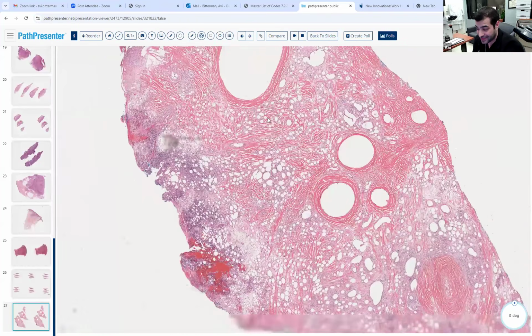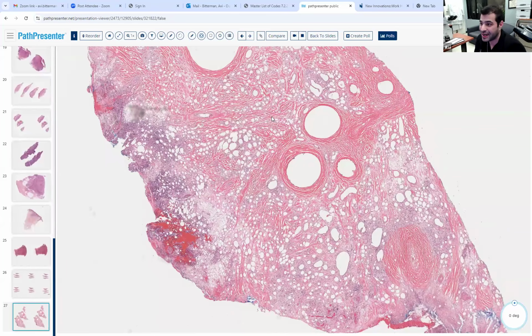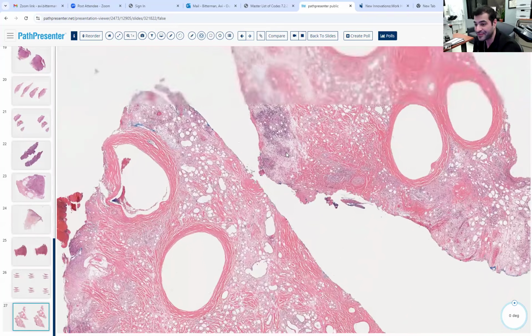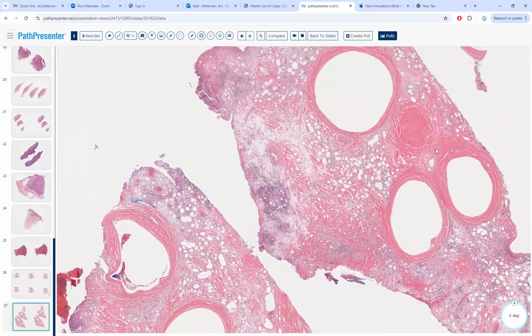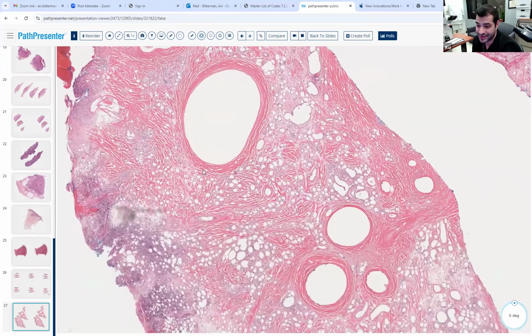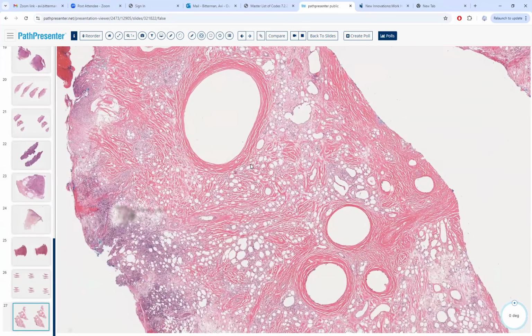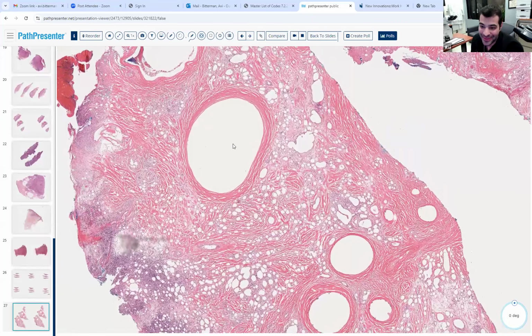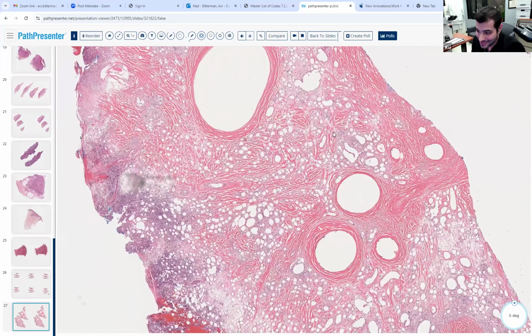Now, don't confuse that with these new fillers. Apparently there are new fillers that are approved and being used for penis enhancement and buttock enhancement. It's wild. So is it just like silicone? No, they don't do this. Those fillers don't look like this. This is a paraffinoma. This is not the fillers that they're doing for penis and butt enhancement, at least not the dermatologists, hopefully. They don't end up looking like this, fortunately.